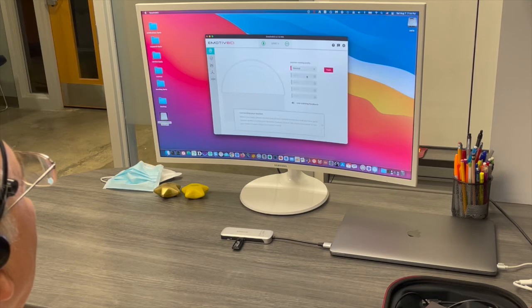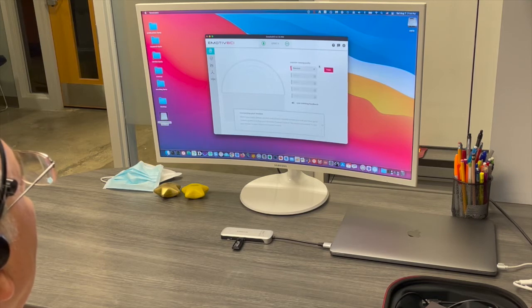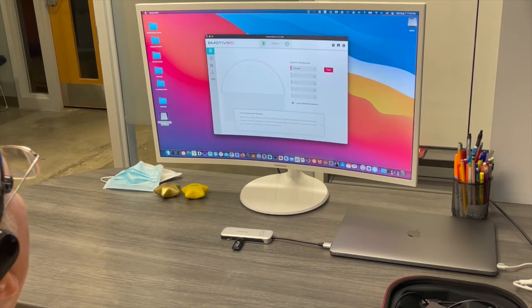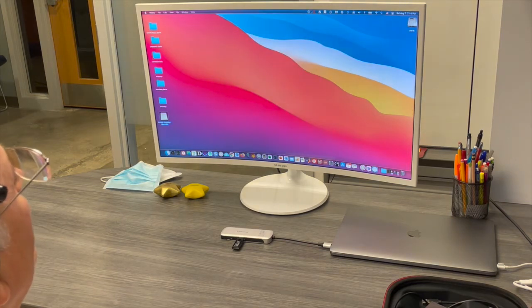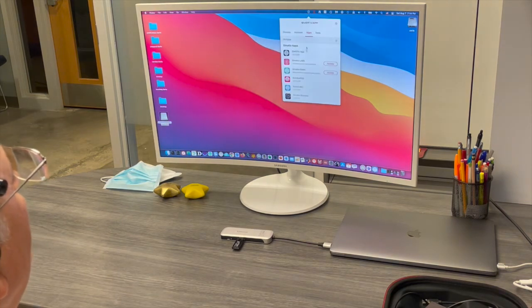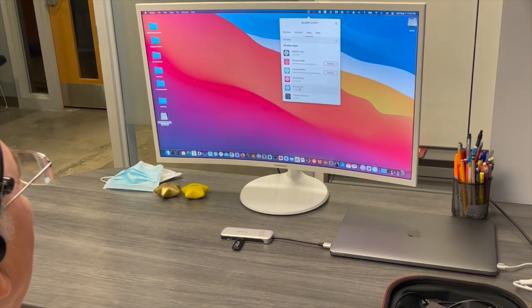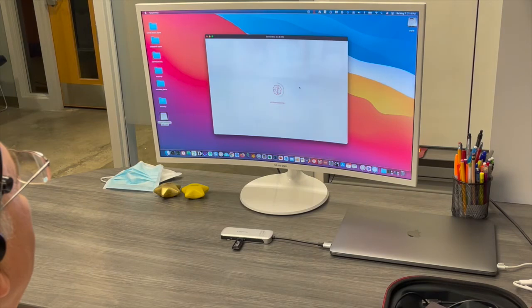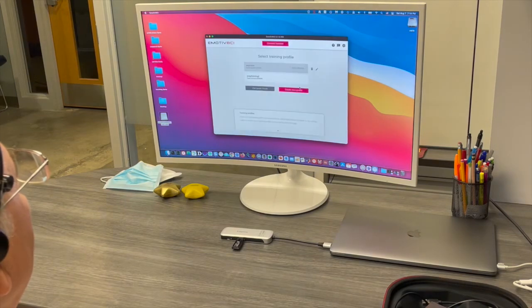The first training that you do is for the neutral position. So basically, that is the baseline of your brain activity. You just relax. It's just the baseline. It's nothing else there. So again, starting the brain computer interface neural network.